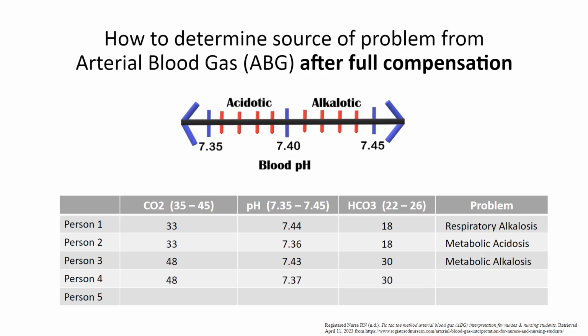Person 4 has fully compensated what? We know it was acidic because the pH is on the acidic side of normal. The high CO2 explains the acidosis, so it's fully compensated respiratory acidosis.